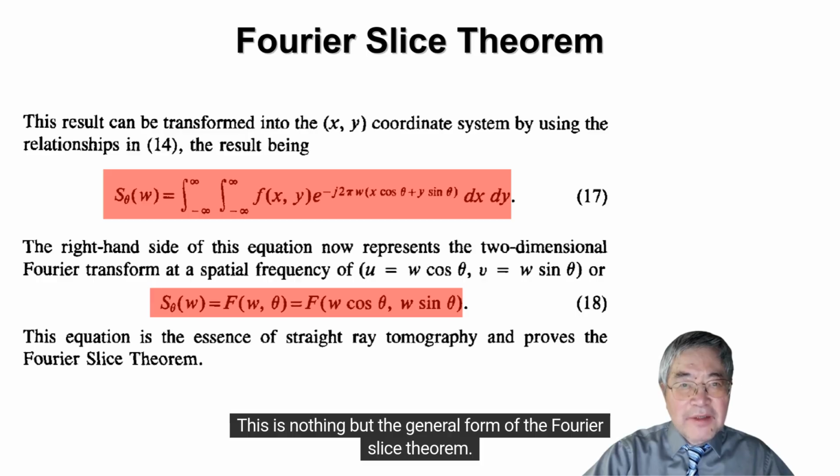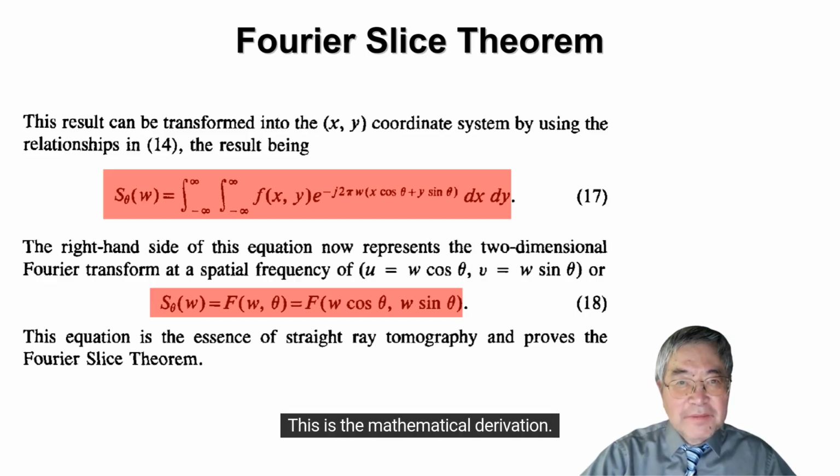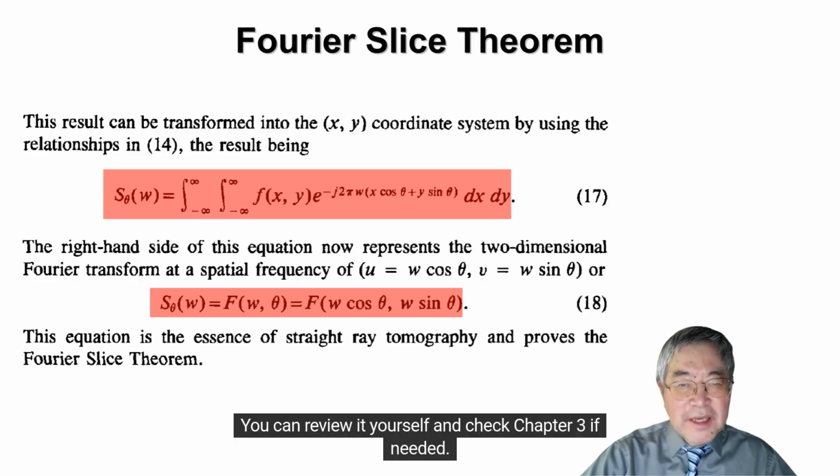This is nothing but the general form of the Fourier slice theorem. This is the mathematical derivation. You can review it yourself and check chapter 3 if needed.